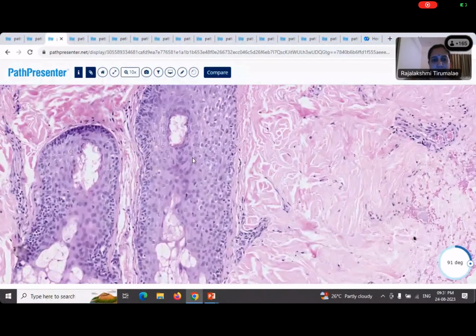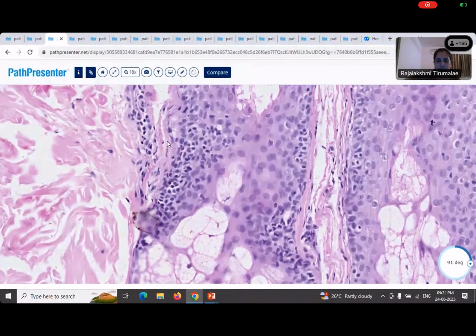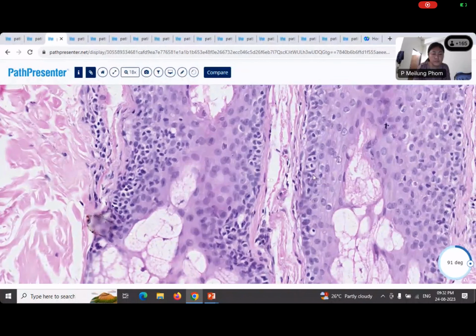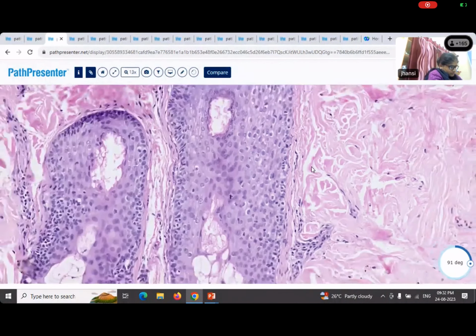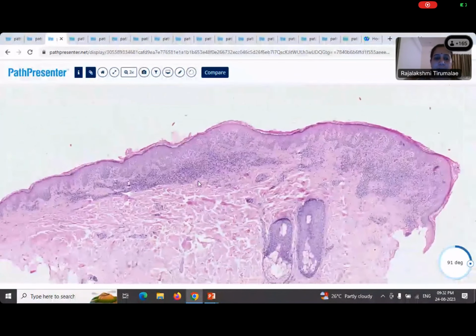You look a little bit at the hair follicle here. Do you notice anything here? Do you notice that these lymphocytes are also peppering the hair follicle? Yes, ma'am. The same thing, the basilar epidermotropism, there is also folliculotropism here. You see that? And there is no basal vacuolar alteration. There's nothing else. It's as if the epidermis is absolutely not bothered by these cells which are coming.